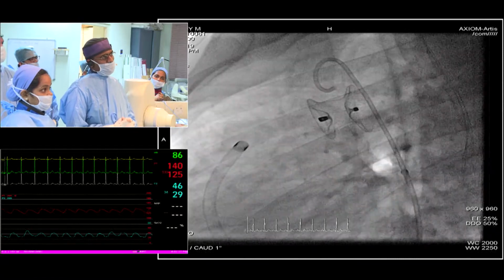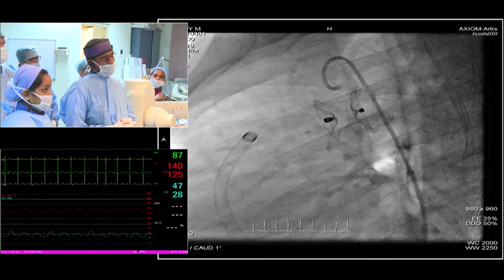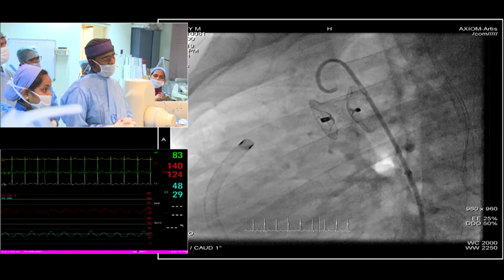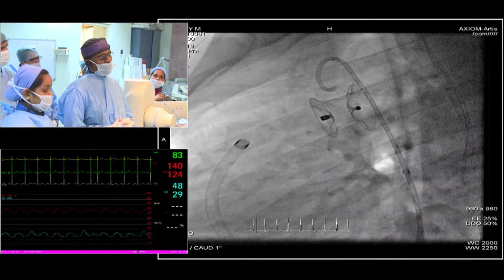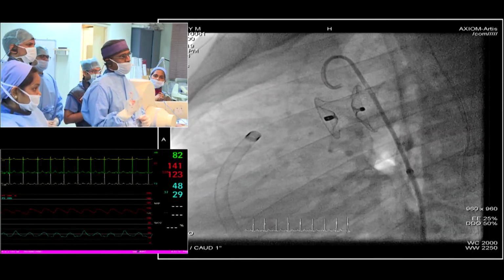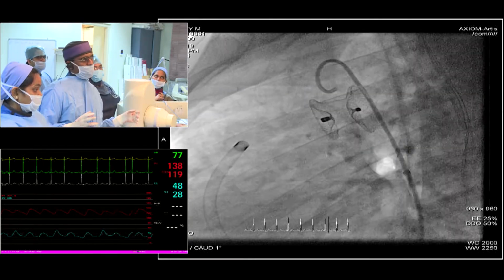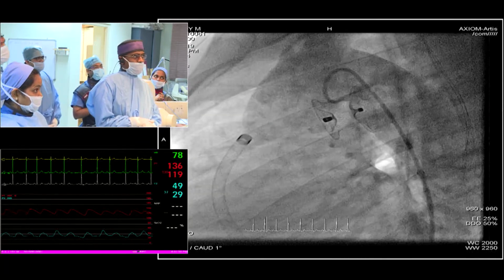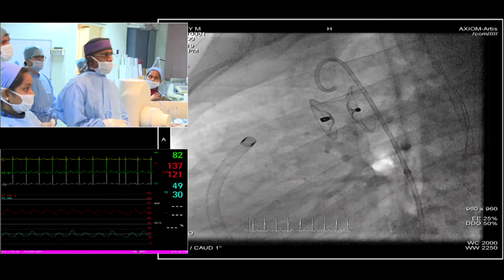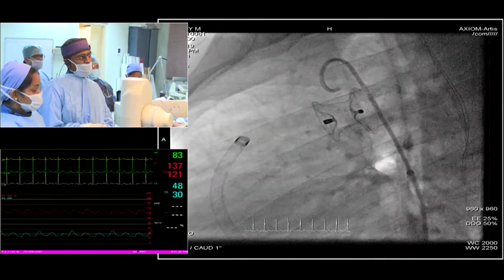Large PDAs tend to be expansile. Why did you not consider oversizing the device in this case? I mean, this has worked out perfectly, but I'm just wondering. A PDA device also could have been a chance. We could have chosen a little larger sized PDA device. I probably would have chosen, if it was available, something like a 26/24 PDA device. However, the maximum size that is available with the Memopart company is only 22 by 20, which will not give me a zone of comfort.